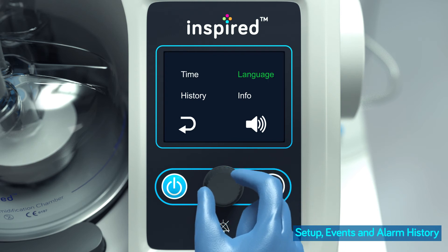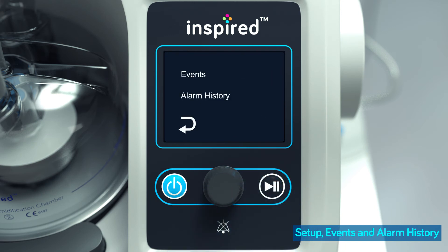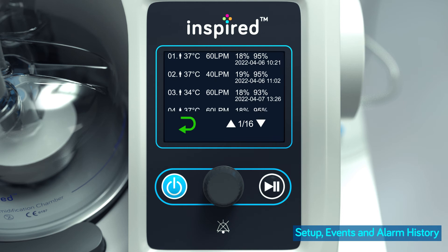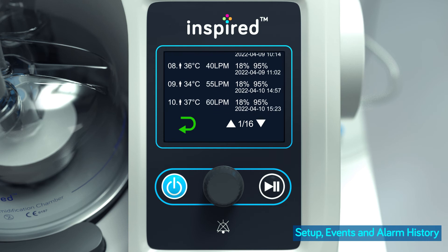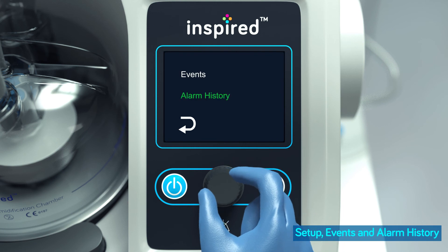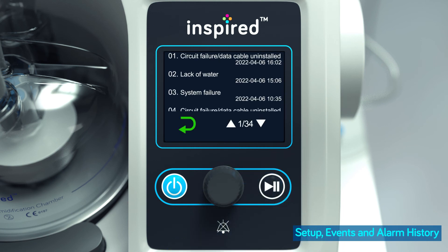Select and highlight history, then press the control knob to enter the history page. Select events from this page and press the control knob to access the corresponding item. In the events page, up to 100 most recent records of changes in settings or operating status can be retrieved. In the alarm history page, up to 100 most recent alarm records can be retrieved.